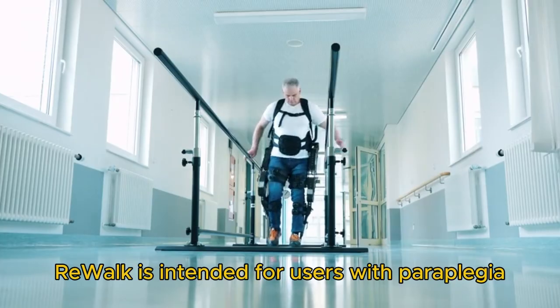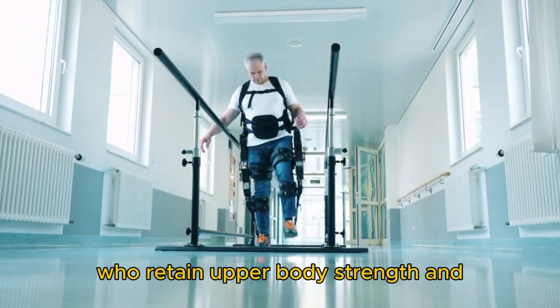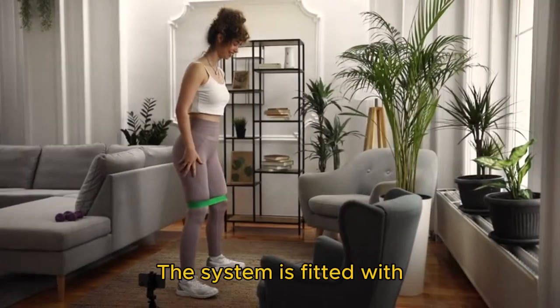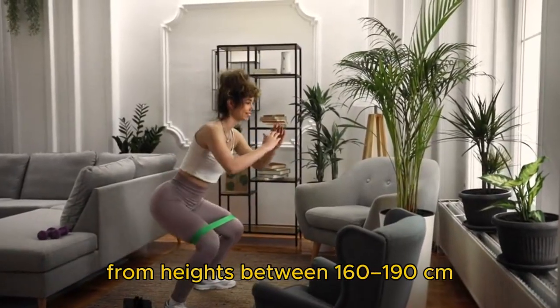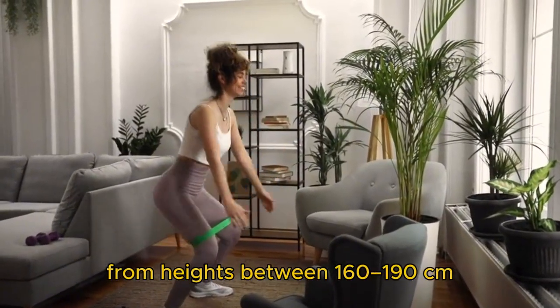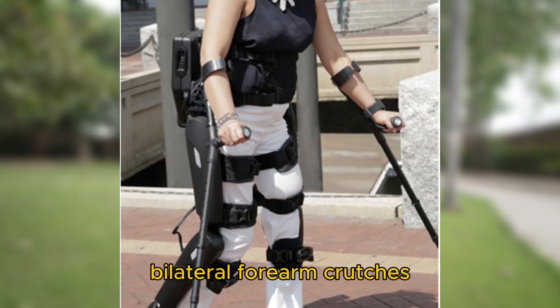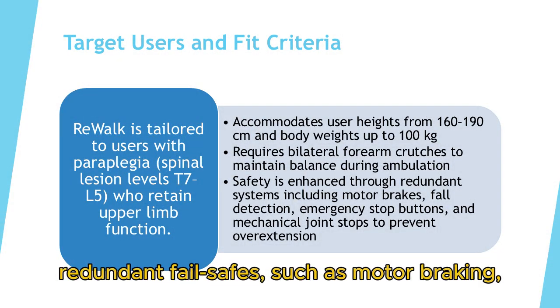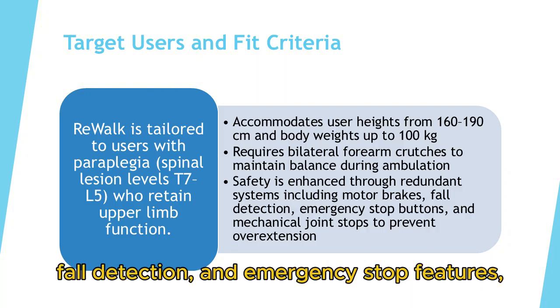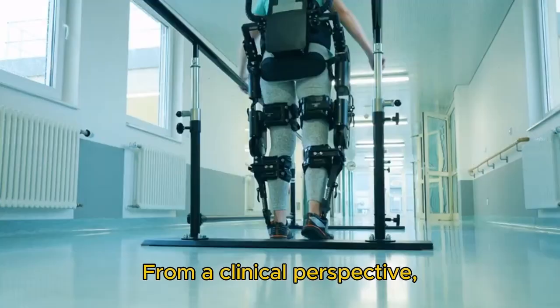ReWalk is intended for users with paraplegia at T7 to L5 lesion levels, who retain upper body strength and functional hand control. The system is fitted with adjustable components to accommodate a range of body sizes, from heights between 160 to 190 centimeters and a weight limit of 100 kilograms. It requires the use of bilateral forearm crutches for balance support. The design prioritizes user safety through redundant fail-safes such as motor braking, fall detection, and emergency stop features, along with mechanical joint stops to prevent hyperextension.